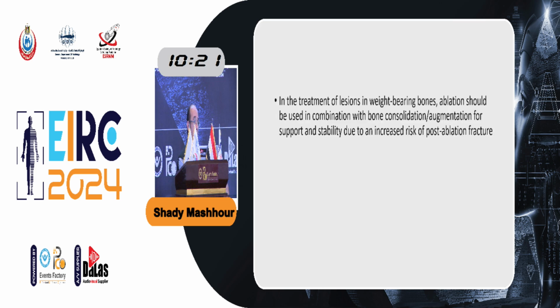However, when we approach a lesion for a curative intent in a weight-bearing zone, such as the acetabulum, such as the iliac bone, or the spine, we usually need to perform a consolidation after, and usually this is via placing some cement.